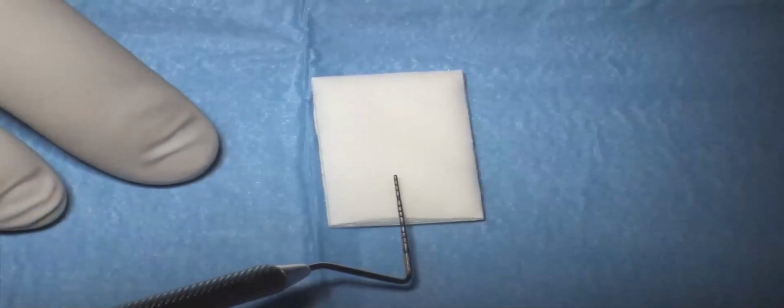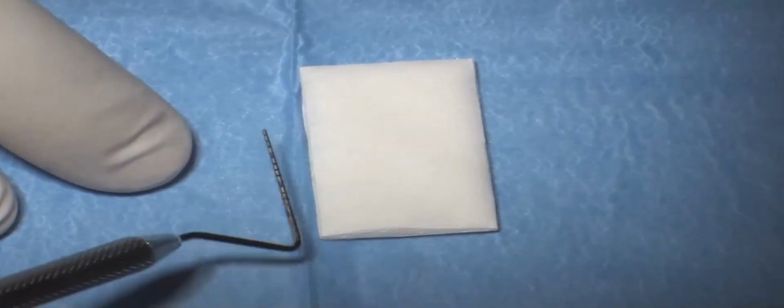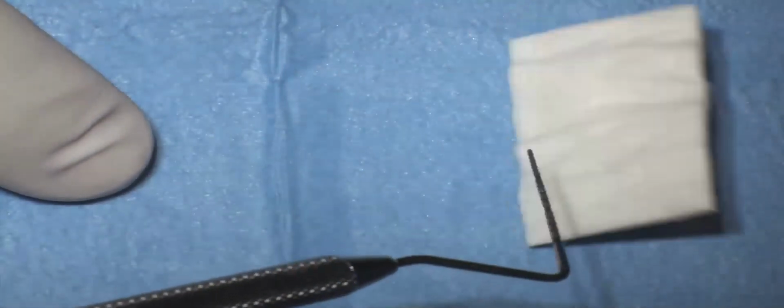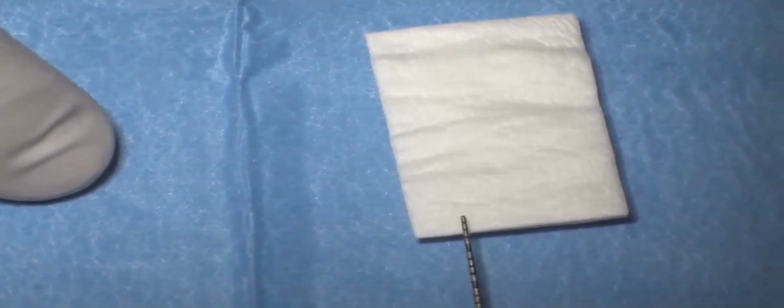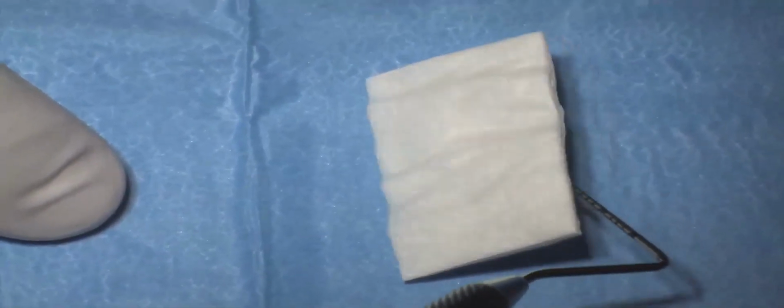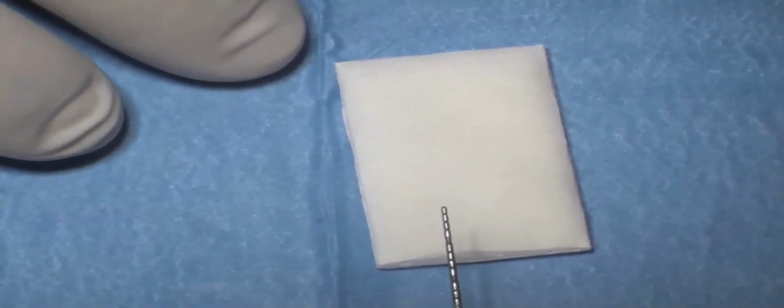You see the thickness of this material? Seems to be more smooth. Is that one facing the root? While this one that seems to be more rough is that one facing the flap. So this is the surface facing the root.